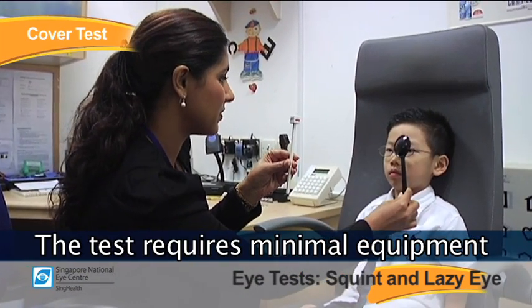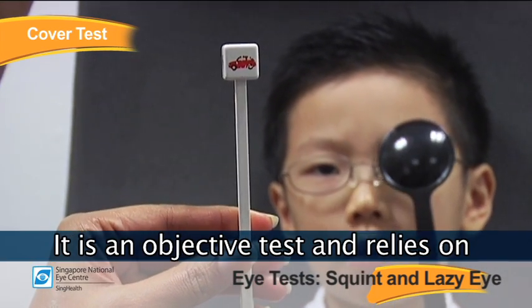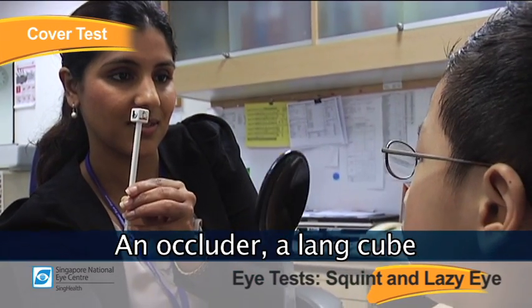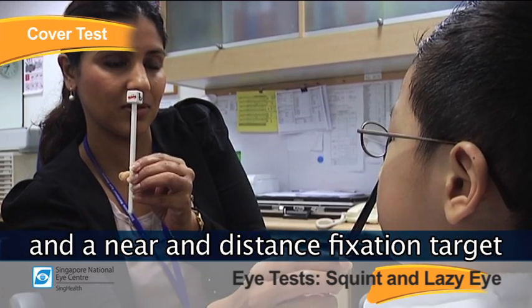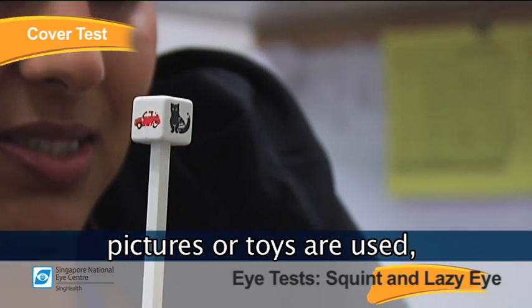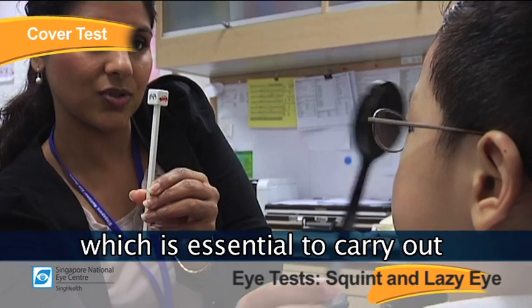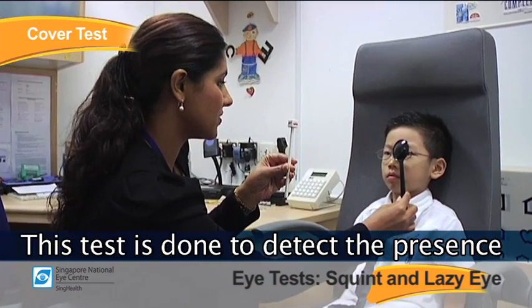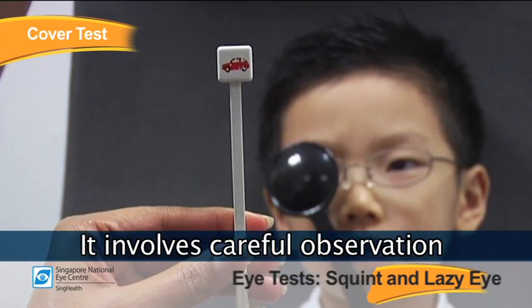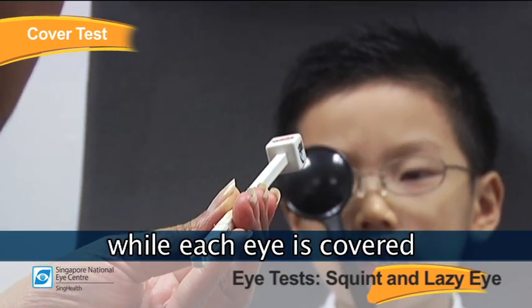The cover test requires minimal equipment and is carried out on children. It is an objective test and relies on accurate observations of the examiner. An occluder, a lens cube, and a near and distance fixation target are required for the test. Interesting fixation targets such as pictures or toys are used as they maintain a child's interest, which is essential to carry out the cover test accurately. This test is done to detect the presence of misalignment of the eyes, and involves careful observation of eye movement as each eye is covered and uncovered.